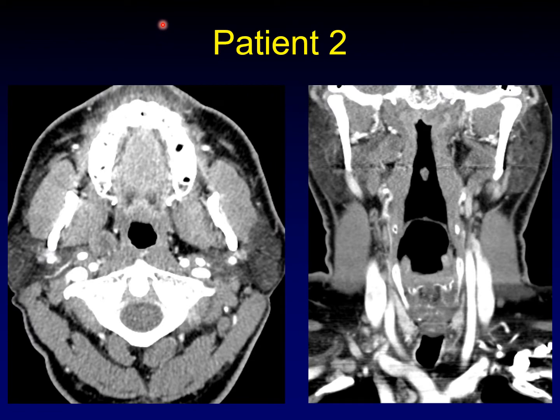Here's patient two. Pretty similar appearance. Here's the mass. There it is on the coronal. Pretty similar, but subtly different.